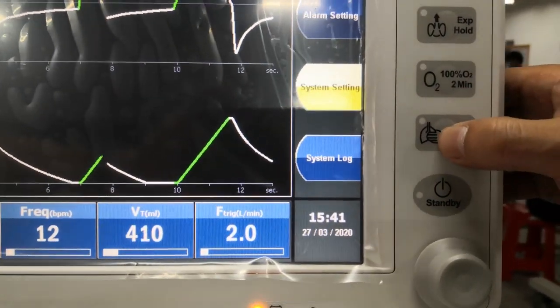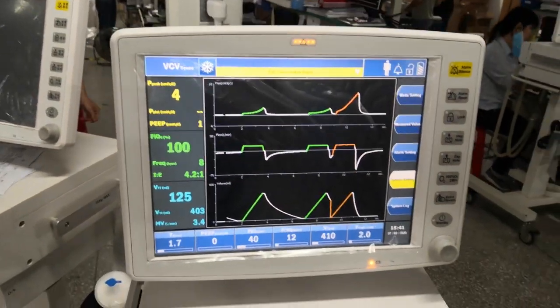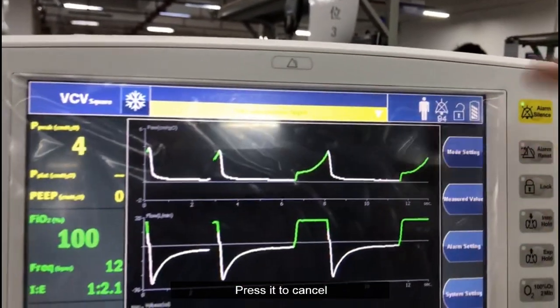Press the extra breath key and the system will supply one extra respiratory cycle. Press this key and the alarm will be muted for 100 seconds. Press it to cancel.